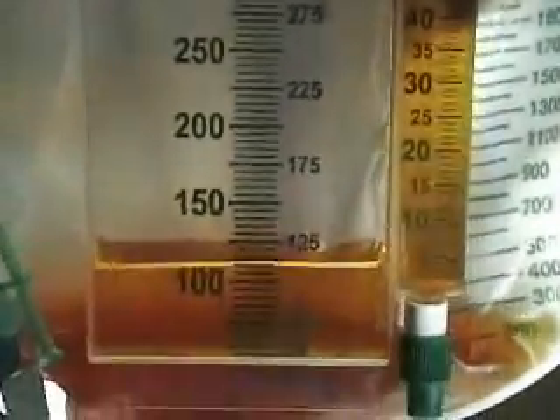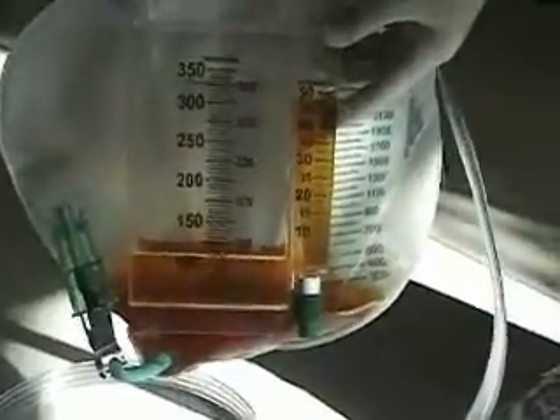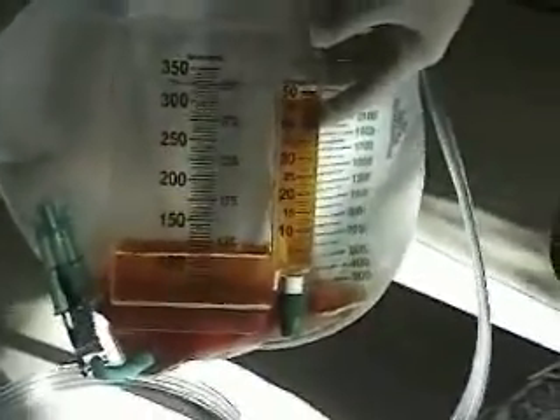This particular Foley bag has a urometer on it, which in the ICU it's particularly important that we measure the urine output hourly. You can see exactly how much urine is in this container, and then after you've marked it and measured it, you can dump it into the bag for that hour and then start fresh for the next hour to measure.